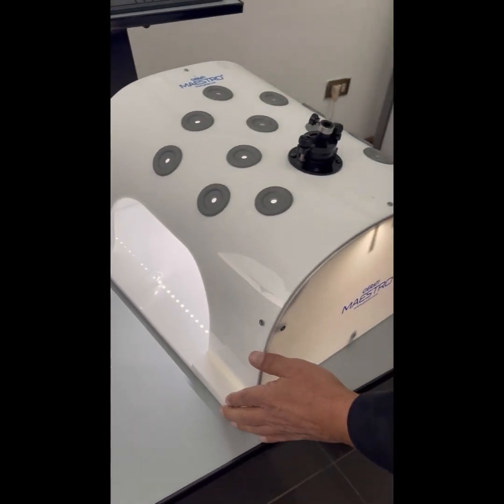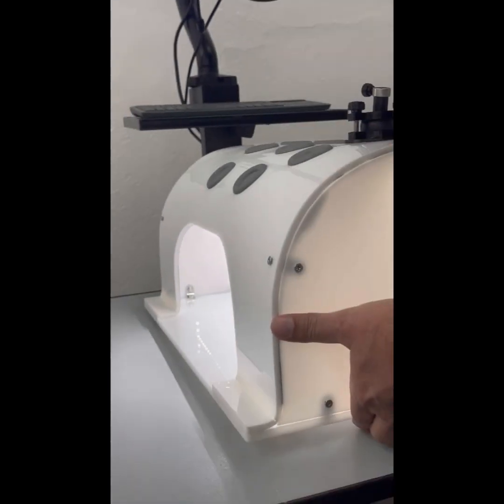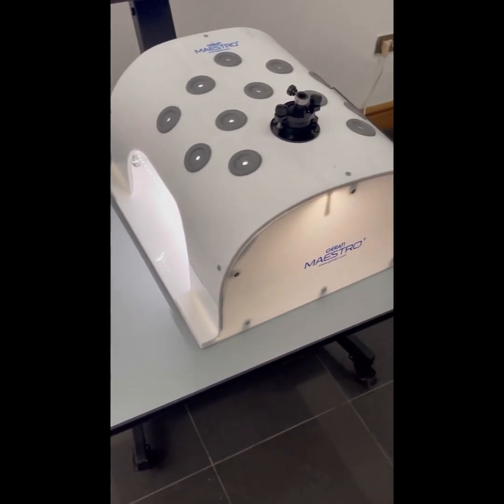The trainer has suction cups underneath so that once you place it in any particular position and press it down, it will not move from that position.